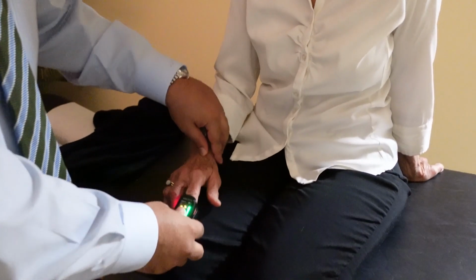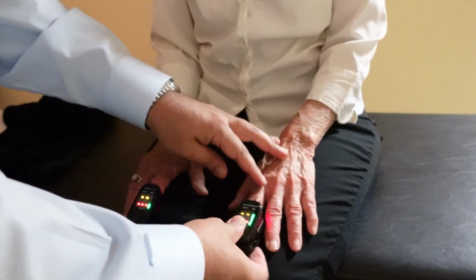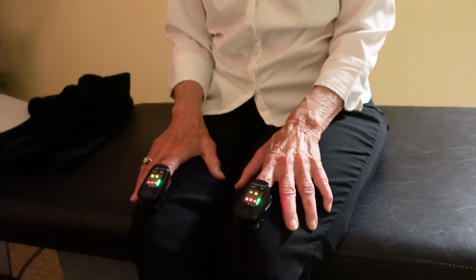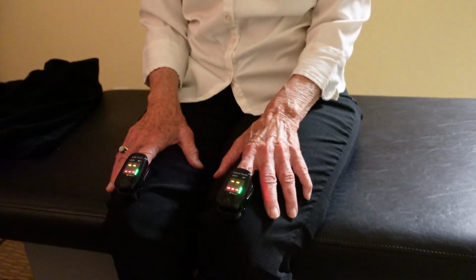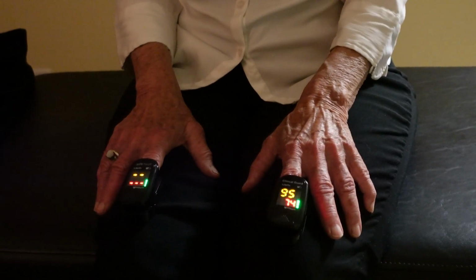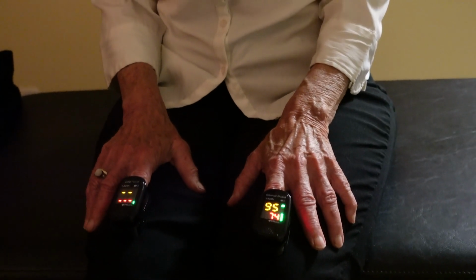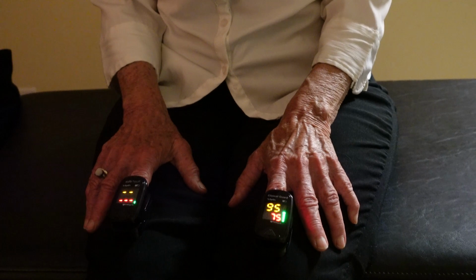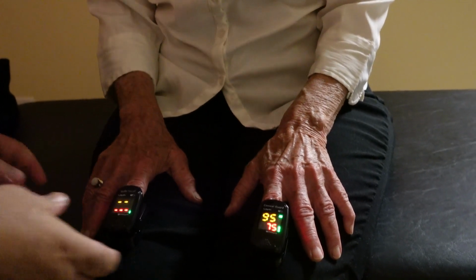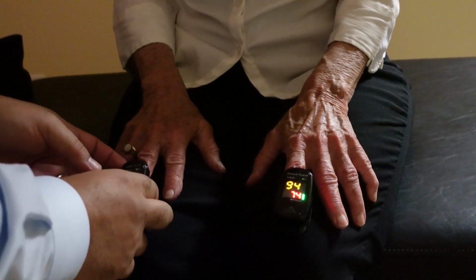And let that rest here. I'm just going to check your heart rate and your pulse ox. Let's use this one.